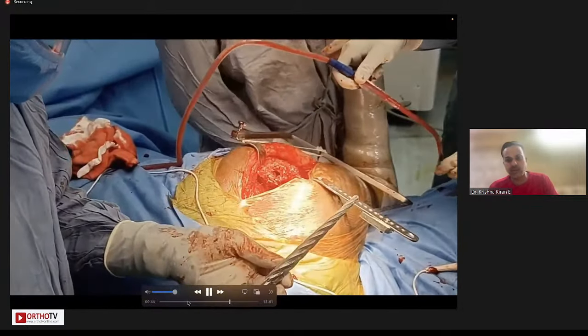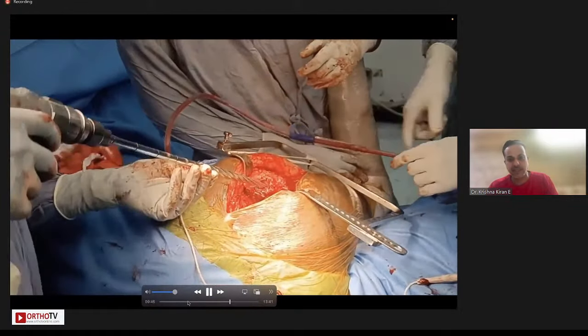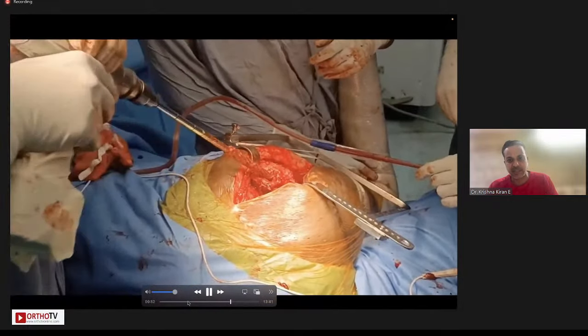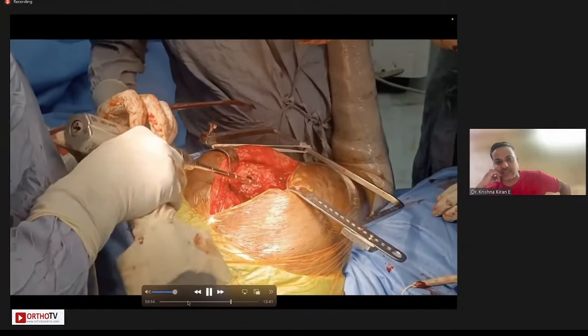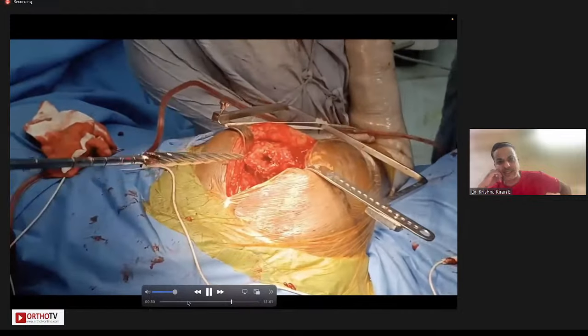Once you do that, now you prepare the femur. You see the leg is held at 90 degrees. I'm preparing the femur using this progressive sequential reaming technique. And in this case, we are using a fluted distally fixing 265 stem. So typically it is done initially with hand.